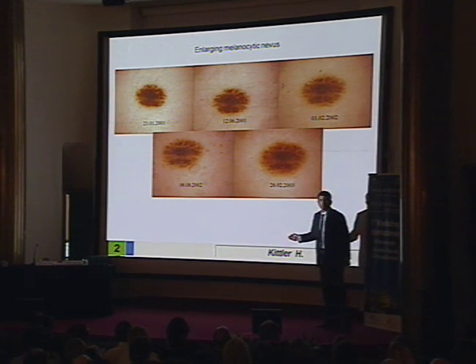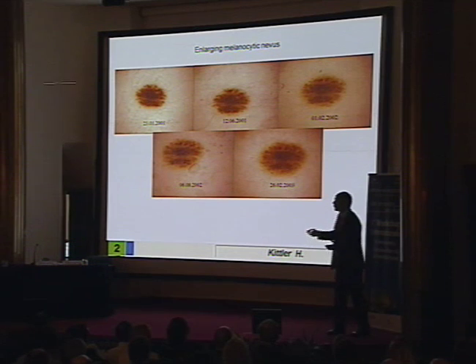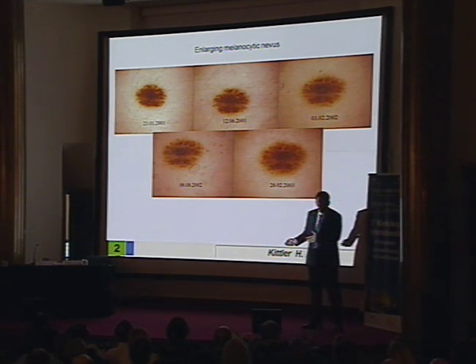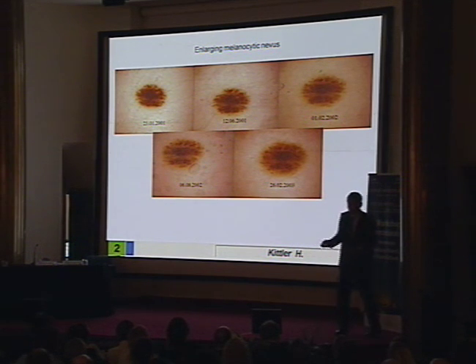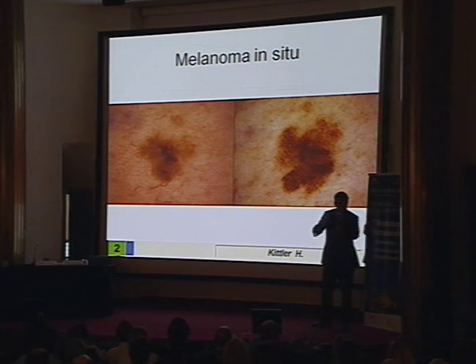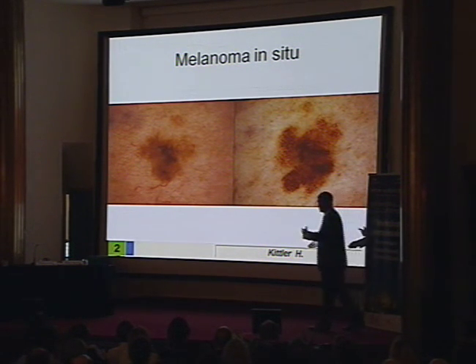This, for example, would be a significant change with short-term follow-up, because there is change, but not a significant change in long-term follow-up, because there is symmetric increase in size. This change would be significant for short-term, because there is change, and long-term, no matter how long you have monitored this lesion.